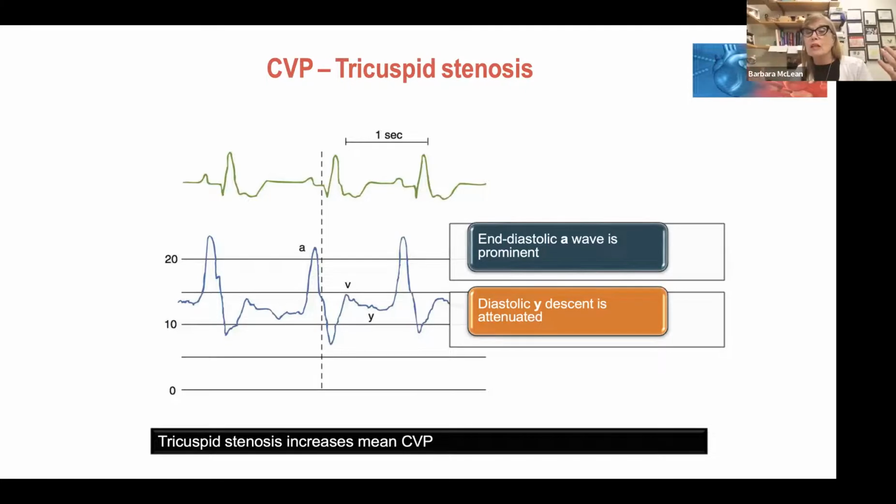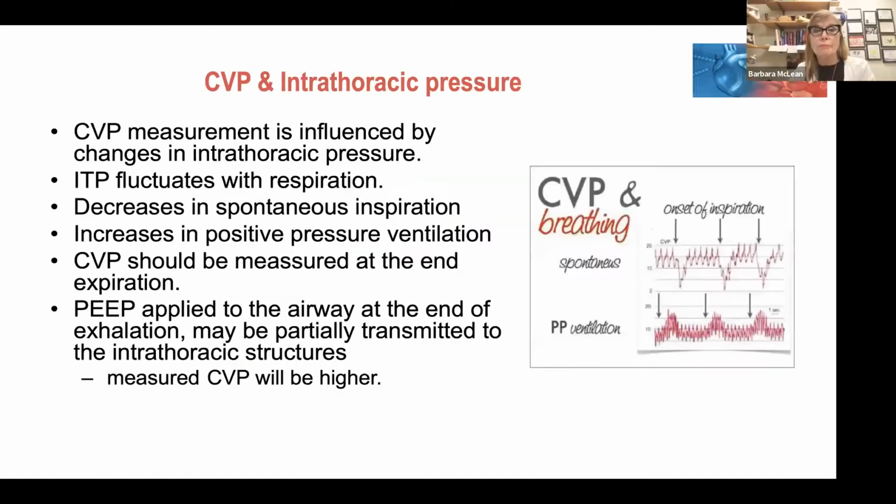And remember, central venous pressure, we use everywhere. We use it no matter where you are. You can be in CV, SI, MICU, emergency room, 12A. We use central venous cannulas all over the place. We need to monitor them and we need to understand that waveform.